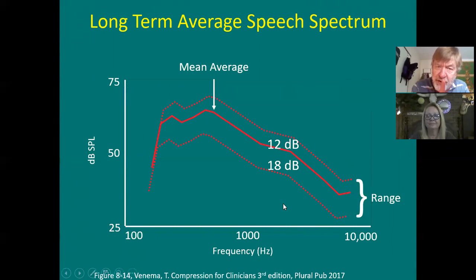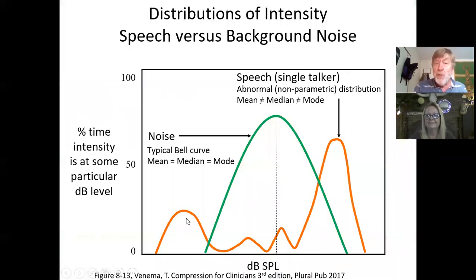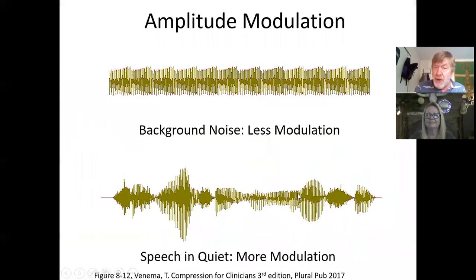I'm telling you this in terms of hearing aids and digital noise reduction, because what a hearing aid is doing is saying, hey man, it's using statistics. And it's saying, is the mean not halfway in the range? Therefore, it must have a weird distribution of intensity. Therefore, yes, it must have a really rapidly changing staccato intensity. Therefore, it must be speech. Therefore, amplify the crap out of it.